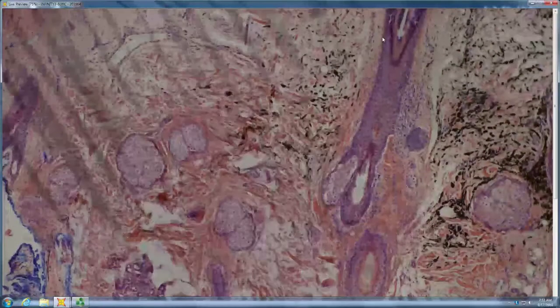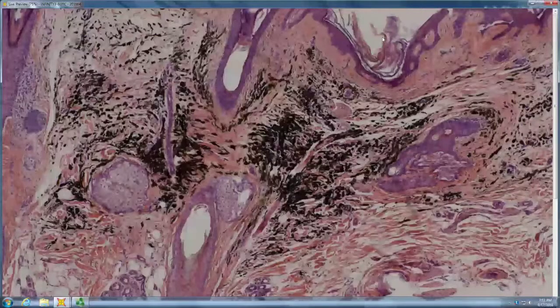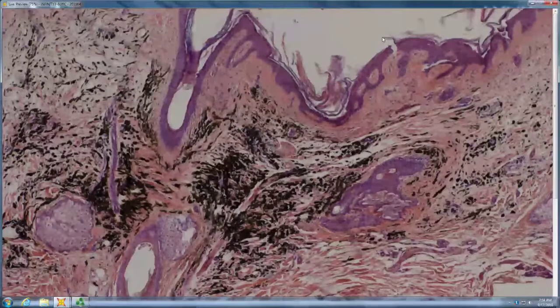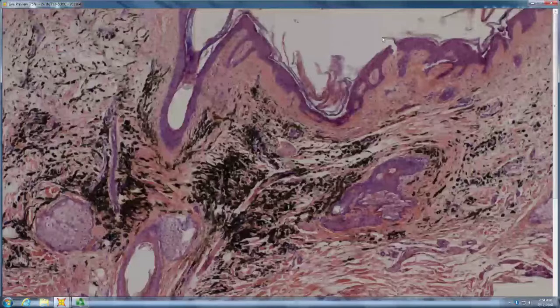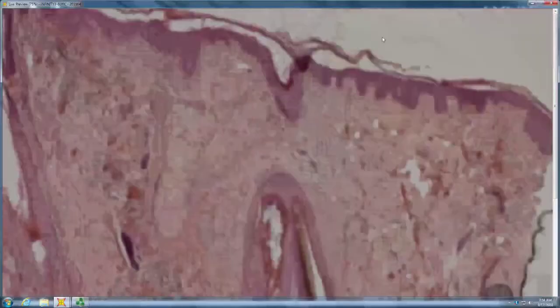Potentially like a blue nevus. Right? So, do you see sclerotic collagen in that blue nevus? Maybe a little bit. So, that's the question. If there's lots of sclerotic collagen, it's a blue nevus. If there's no sclerotic collagen, then you've got to worry about metastatic melanoma, or blue nevus-like melanoma, uveal type melanoma. So you can look for Ki-67, you can look for BAP1 deficiency, you can look to see if the collagen blacks out, which it does sort of in this case. So blue nevus, you are correct.